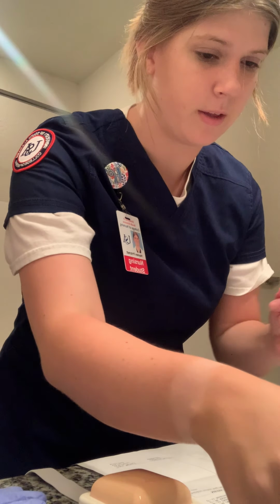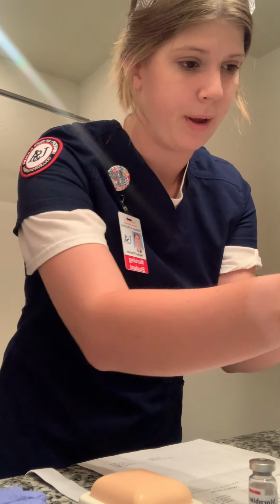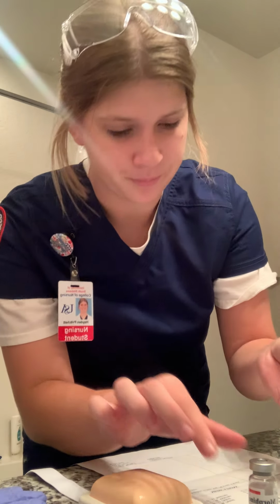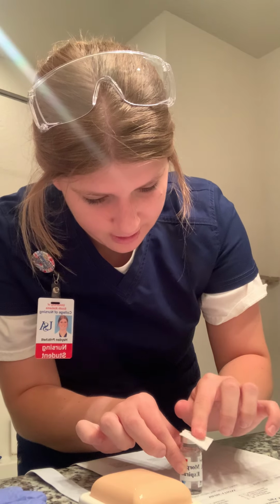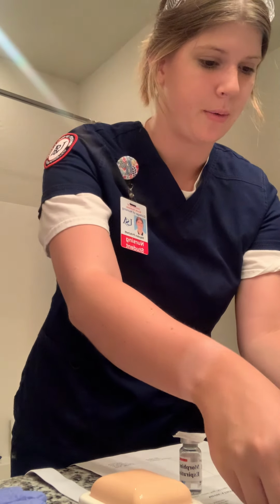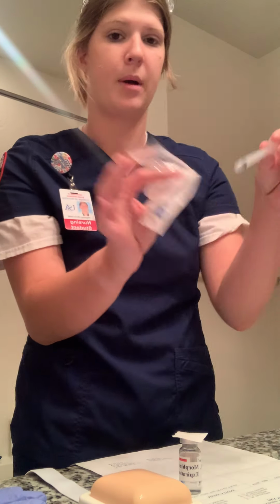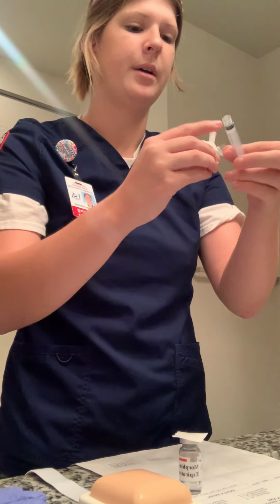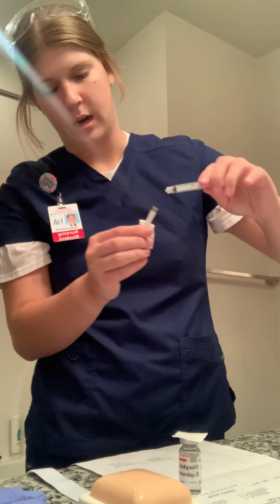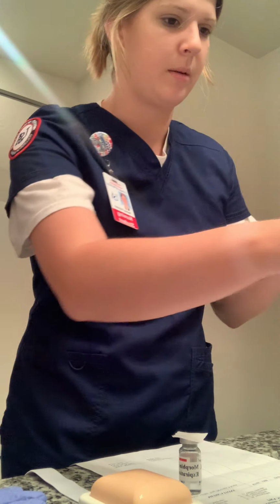Okay, so the first thing I'm going to do is open my alcohol pad after I did hand hygiene. Then I'm going to clean the top of this vial, but I'm also going to leave it there so that it does not get contaminated. I'm going to open my syringe, and I'm going to grab my cannula, and I'm going to screw that in.